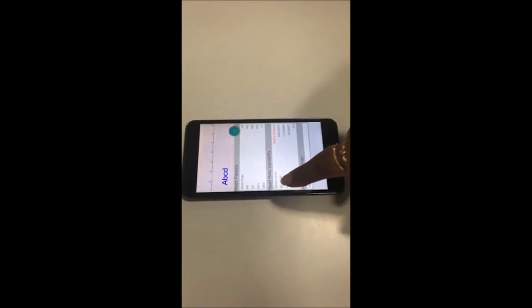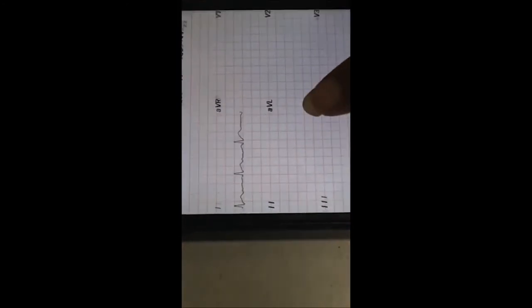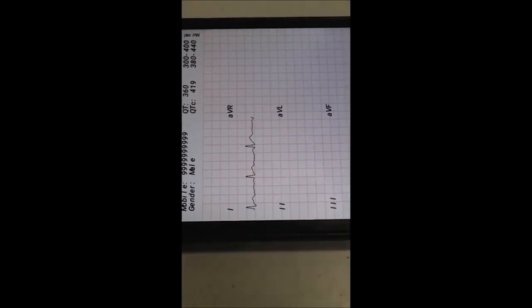Here you can see the result. It shows heart rate, PR interval, QT interval, QTC interval, QRS. Even it shows your stress level, whether you are highly stressed or slightly stressed or calm. If you want to generate the full report of your single lead, just click here. The full report for single lead is generated.